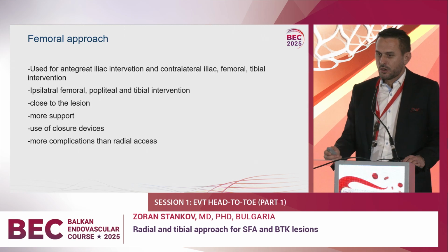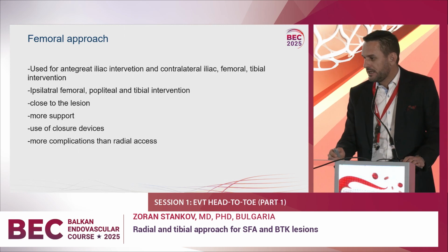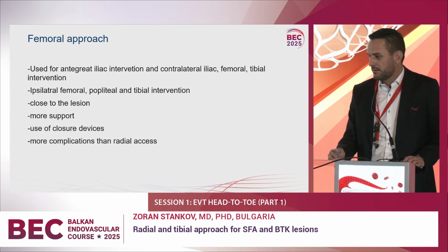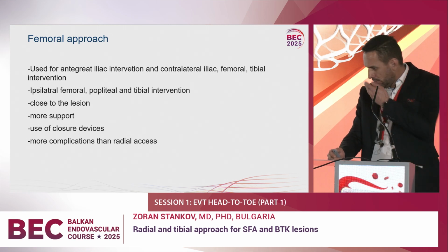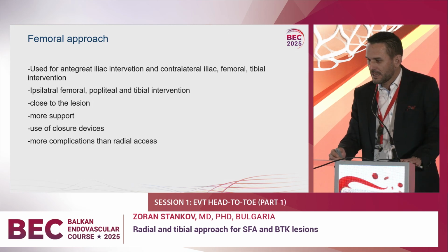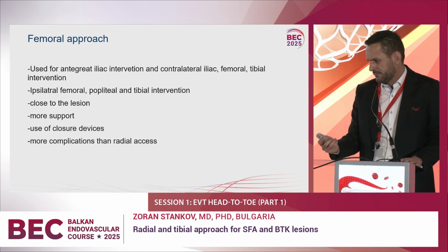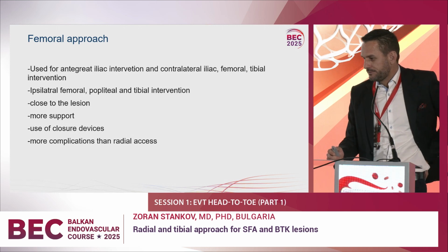The femoral approach is a very good approach for peripheral artery disease because it can be used for the contralateral procedure, for the iliac intervention, femoral tibial intervention, ipsilateral popliteal and tibial intervention. It's very close to the lesion, and this gives us more and more support for the calcification and more support for the device crossing from the lesion.